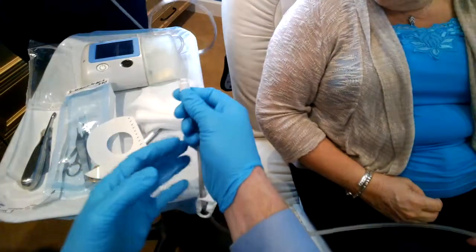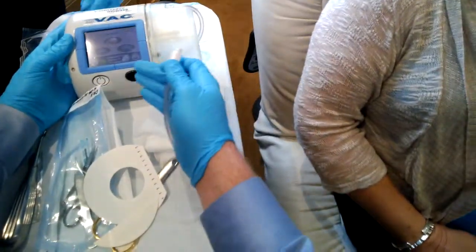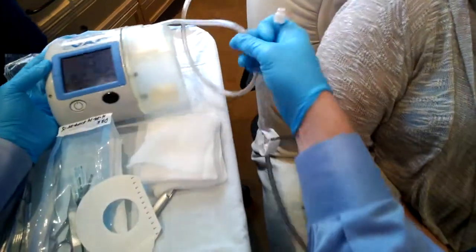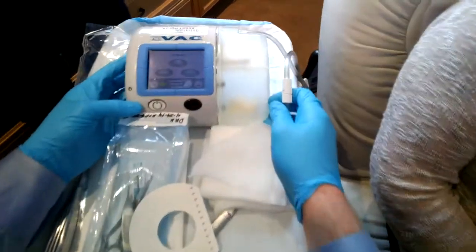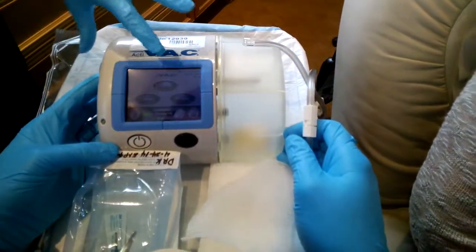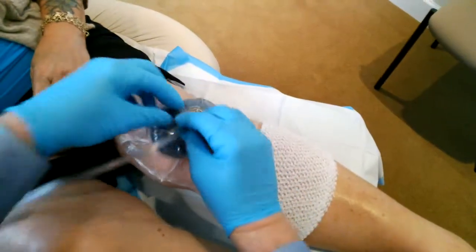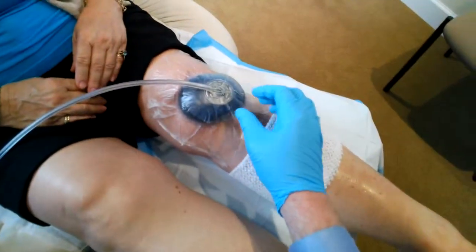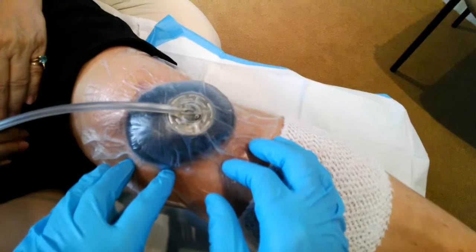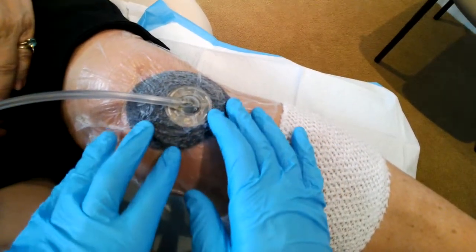Let's look at our device here and connect the tubing to the canister. Here's our wound vac. There are settings here that allow me to generate negative pressure, and there's this canister that will collect fluid. Our settings are going to be 125 millimeters of mercury — it's basically like a little mini vacuum cleaner. I just have to remove this last piece of seal, and then let's go ahead and turn this on. You'll see the sponge squeeze down, and now we have our negative pressure.